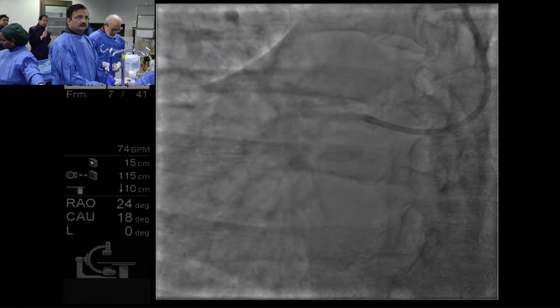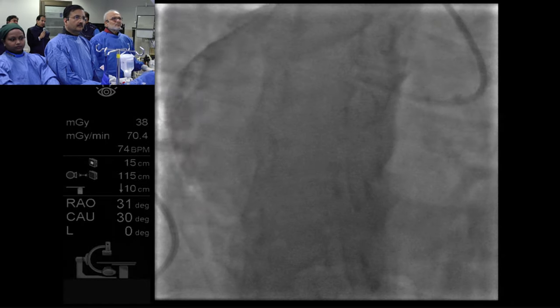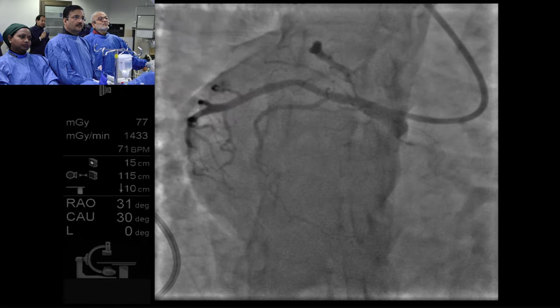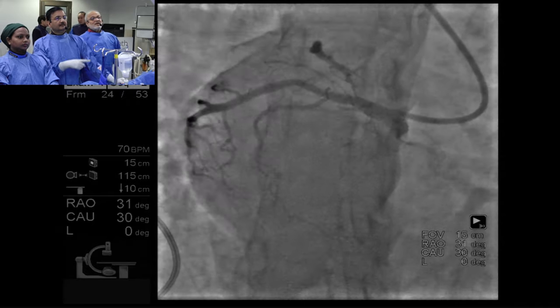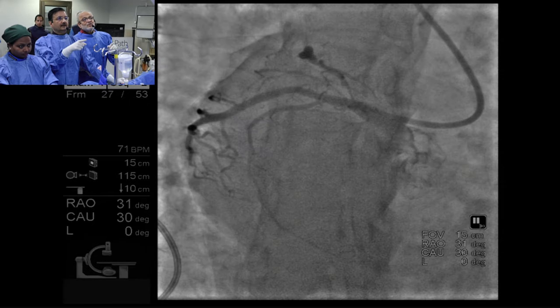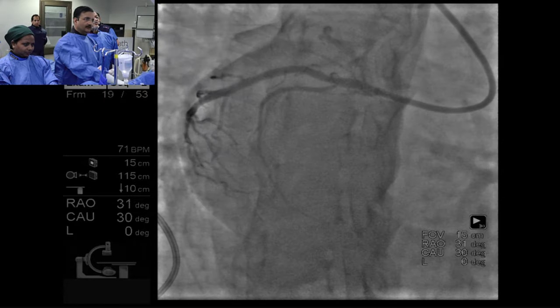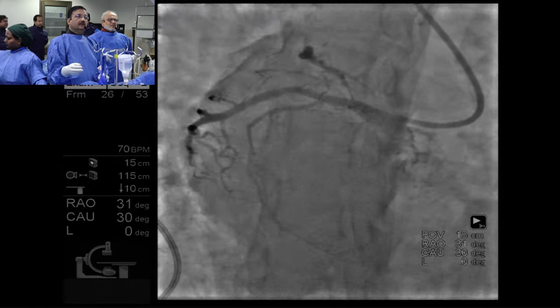I think the strategy has changed ever since lithotripsy. I think I would do the same here. Wire, non-compliant balloon, and lithotripsy. And if it's non-dilatable, then I'd go with rotablation. We have to pull the guide back. What I think is we can put... Yeah, it is just the guide. We would do an NC balloon first. Sure. Yes. Cutting balloon, get an imaging, and then assess.